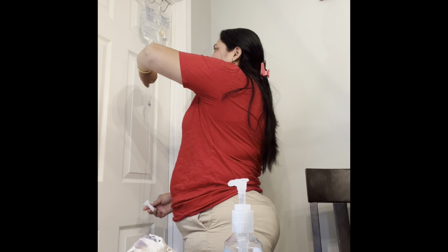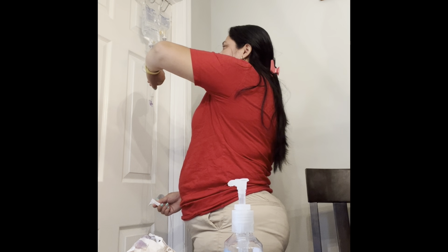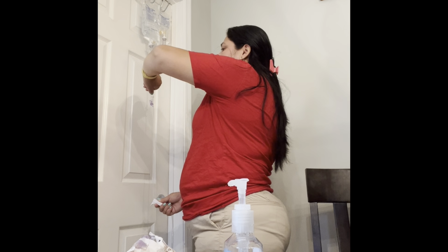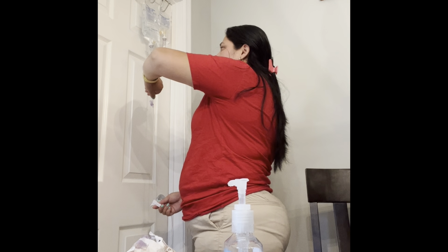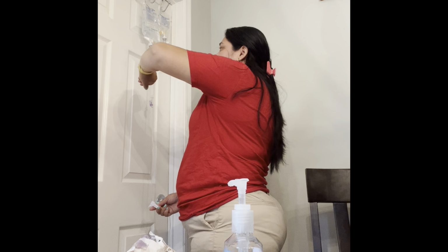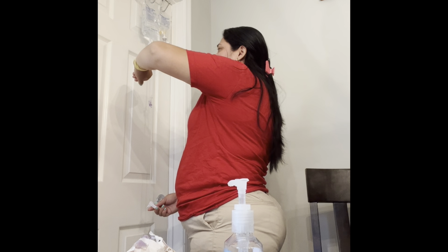The time is now. 1, 2, 3, 4, 5, 6, 7, 8, 9, 10, 11, 12, 13, 14, 15, 16, 17, 18, 19, 20, 21, 22, 23, 24, 25, 26, 27, 28, 29, 30, and 31. So 31 drops per minute.